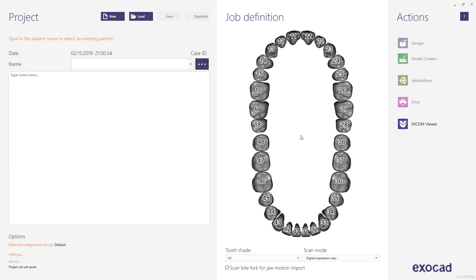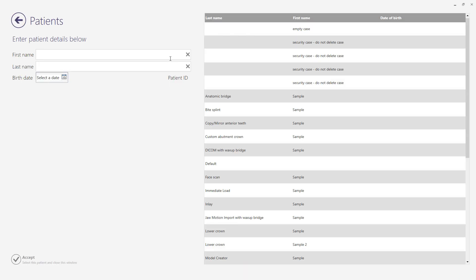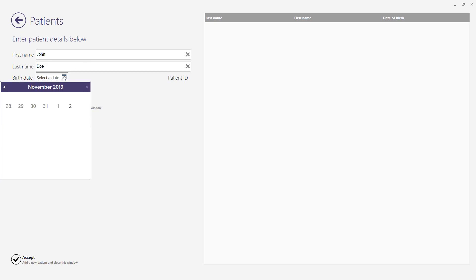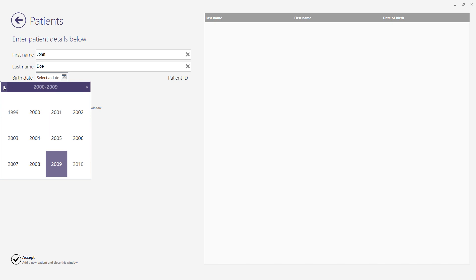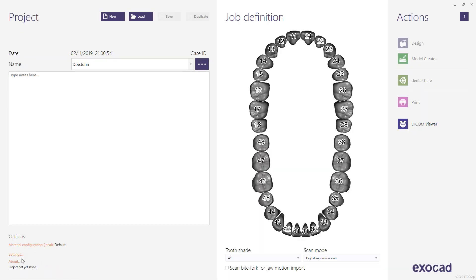To begin, run the ChairsideDB application. There is a user guide indicating how to proceed. To set up your first case, you can type in the patient's name in the name field or select the ellipsis button to add a new entry. Enter the first name and last name. Select the date of birth by navigating through the calendar — choose the desired year, month, and day. Accept the entry.